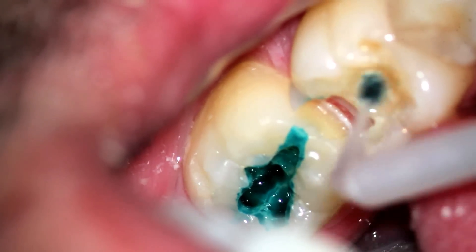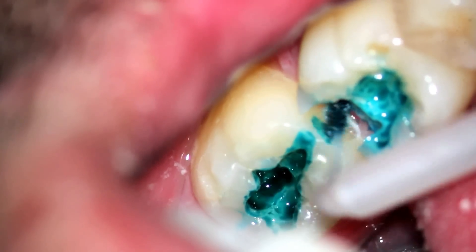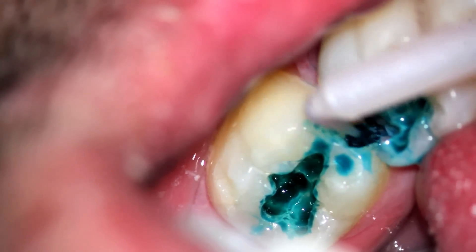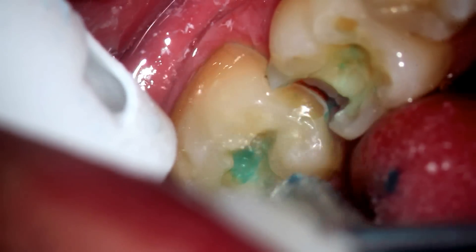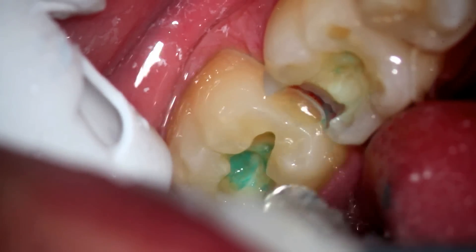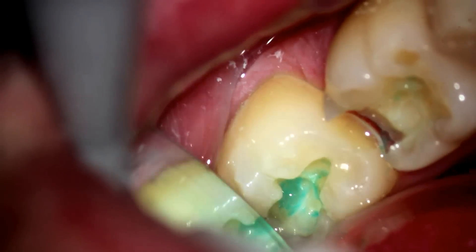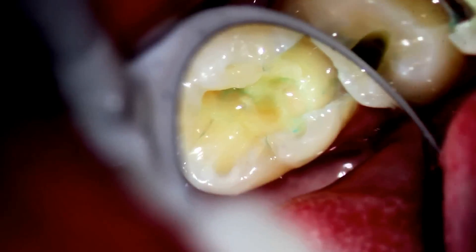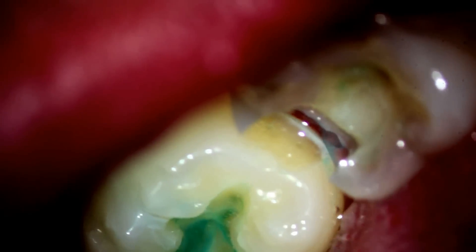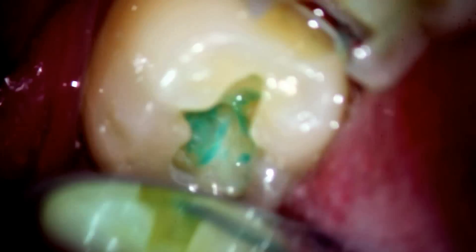Now here I am putting in some decay detector. I'll usually do that once just to get an idea if I'm missing anything. As it gets deeper, the decay detector isn't quite as effective. But you can see lots of green indicator on the second molar and how deep that is — and not quite so much on the first molar, but it's still there. So we'll go ahead and remove those areas and then open up the tooth, particularly on that second molar, so that the light can penetrate up underneath the cusp.